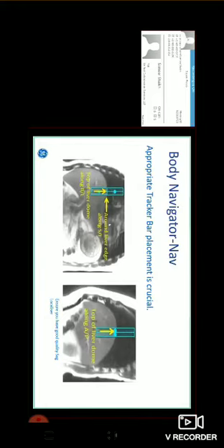Especially for the company. So we call it parallel imaging techniques to speed up your scan, reducing the scan time. You have two options.